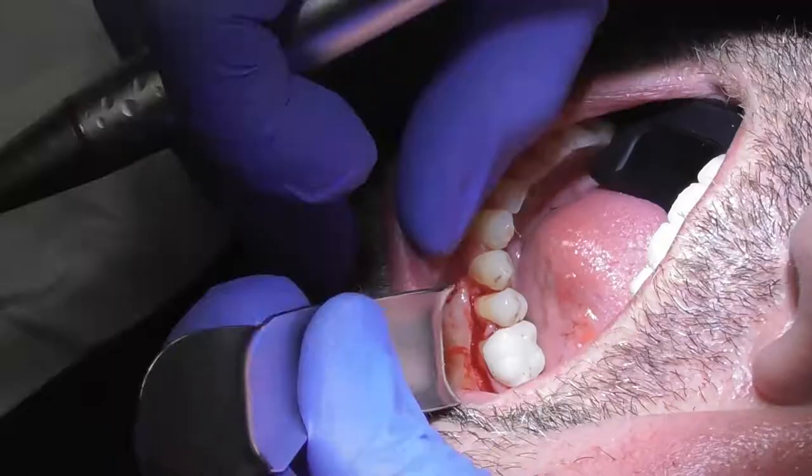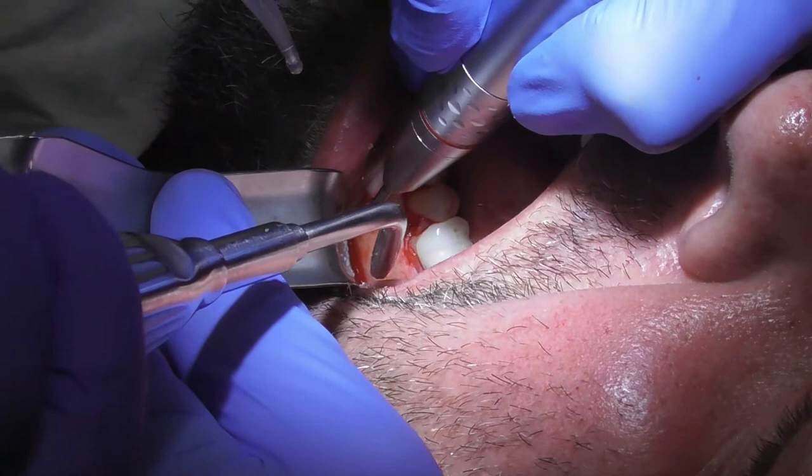There's a little edge lower that I'm going to switch and address. Just a little edge right there — let's go ahead and smooth that down.